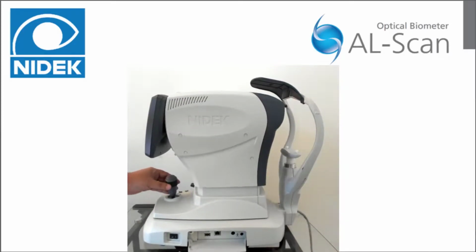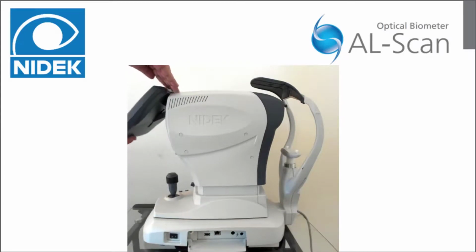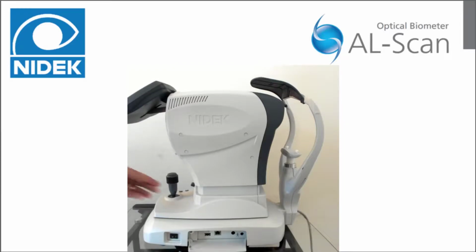The joystick controls the movement of the device, as well as the start button on the top to begin measurements manually. The LCD touchscreen is able to be tilted to allow for improved viewability. The locking lever is located behind the joystick. This is used to move the device if necessary.